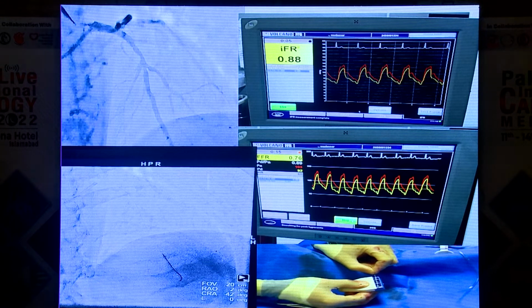I stented that. And after stenting, actually, you can do a remeasurement post-stenting as well by reconnecting the wire over here. Just slide it back, put it in. You just have to align the links properly, and you can use it in multiple vessels with that. So that's how you do the FFR wire and setup. Basic, but need to remember all the steps to do it properly.